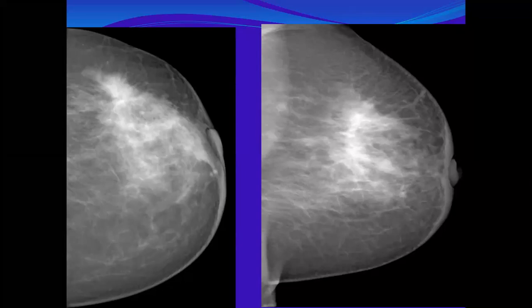Okay. So you describe it in the craniocaudal. I describe it as a spiculated mass because it obviously has spicules. So this can be distortion. Yes. It depends. You might say this is the mass. But if you look at this, what about this? This is part of the mass. All are abnormal. This area looks like, yani, multifocal.